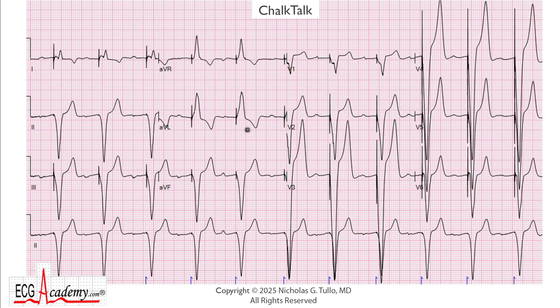Hey, it's Dr. Nick with the ECG Academy, and this week's Chalk Talk is a 12 lead, but we're concentrating mostly on the rhythm. The first thing that should pop off the page at you is the fact that there are these big, giant spikes in front of each QRS complex. These are pacemaker spikes. You can see them in front of every beat, and you can see that the QRS starts immediately after this spike, so this looks like a ventricular pacemaker.